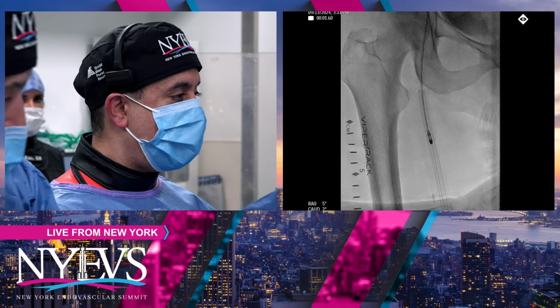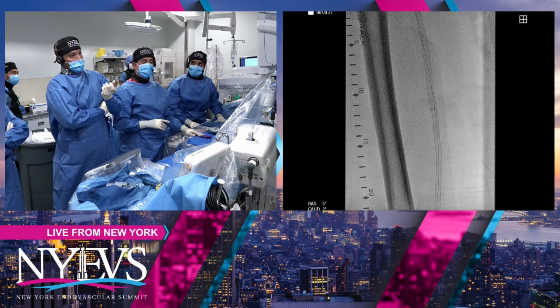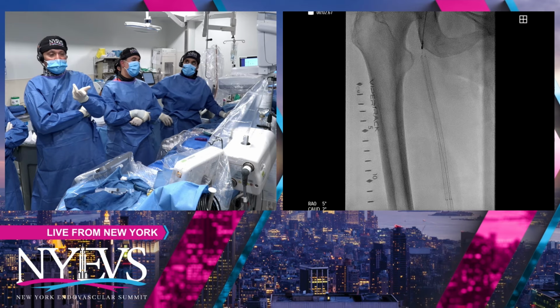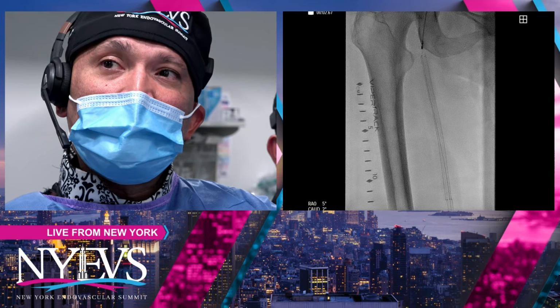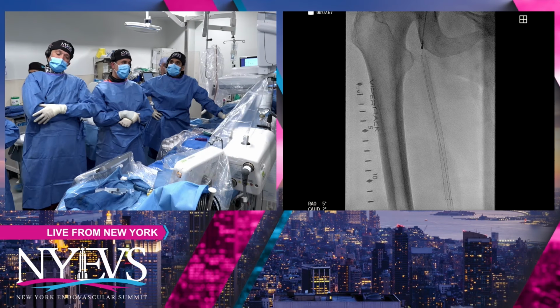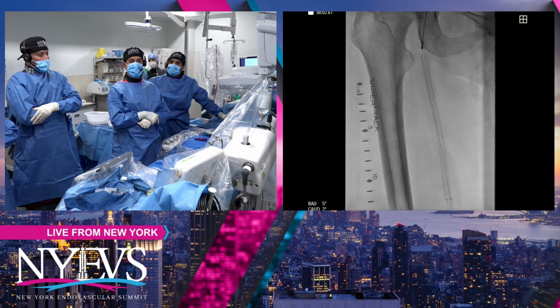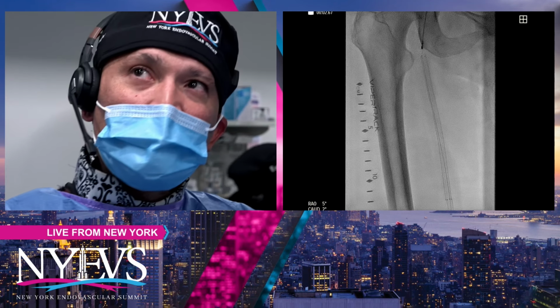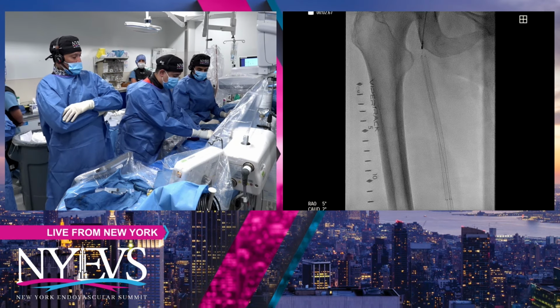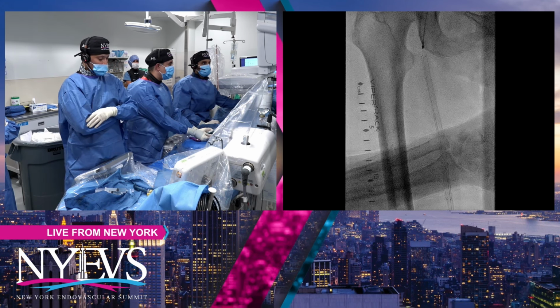So I have a question for the panel. Knowing that it's a 6-0 stent, would you guys think the 8 French Rotarex is a little bit too aggressive for a 6-0 stent, or would you just go with a 6 French? Dr. Zeller? Well, 8 French is not too aggressive, but 6 French would be big enough in order to remove the thrombus. In a small vessel like this, that would have been my first choice. But anyhow, if you predilate now the origin of the SFA, you will be able to cross also through the Supera stent.